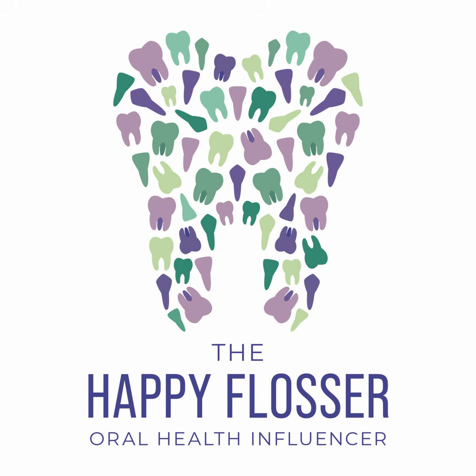So think about this as well. Each 15 kV increase increases the number of X-rays. The exposure time must be decreased in order for you to maintain the original sensor density, the original image density. Each 15 kV decrease reduces the number of X-rays, and as a result, your exposure time must be increased in order for you to maintain the original density.